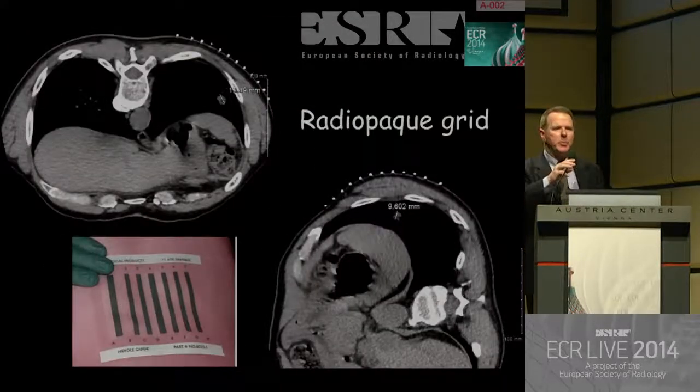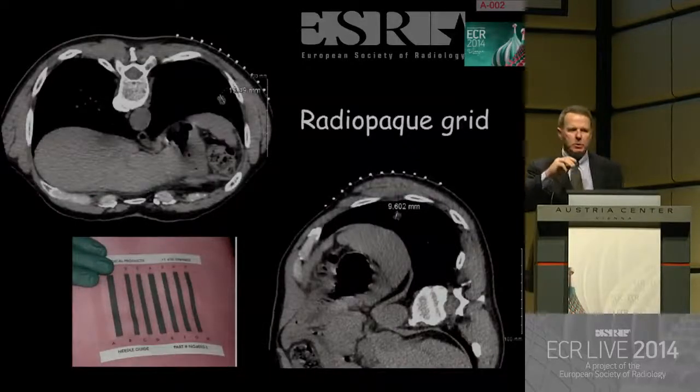Other people use radiopaque grids. It's feasible. You can make your own grid at home, or you can buy one.